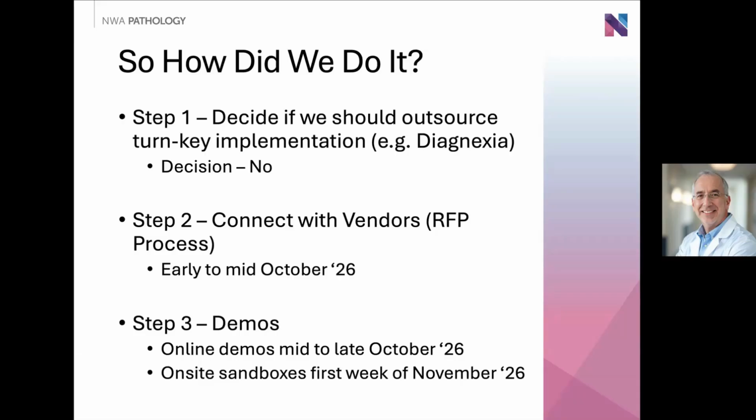Last October, we connected with many vendors at the Digital Pathology Association meeting in San Diego. We interviewed vendors, explored their capabilities, and worked to understand what each could provide us. From that process, we released an RFP with responses due a couple of weeks later in mid-October. We then moved into a series of online demonstrations with different software vendors during the latter part of October. After that, approximately 7 to 8 vendors came on site to set up sandbox environments within our practice. Each vendor had a day to meet with our pathologists and walk through the software in detail.